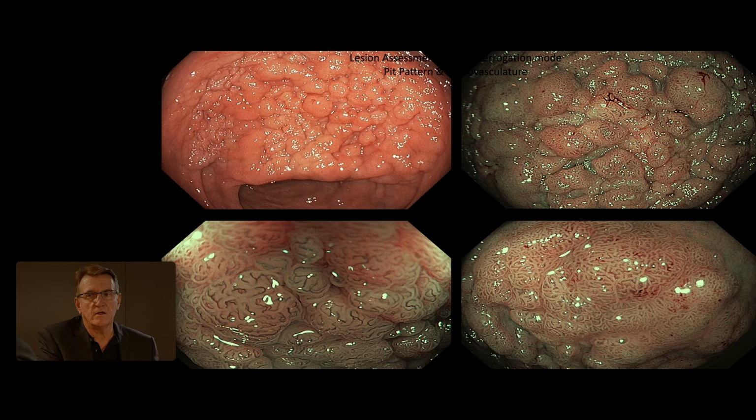So this is a benign lesion. The background of my question, a little bit provocatively, is that I've seen quite a few live demos where somebody said this could be a little bit irregular, with the intention to do ESD. And of course, histology the next day shows a low-grade adenoma. So that's not the challenge. If it's homogeneous in overview and you have some focal views, then you can be not 100%, but very, very sure that this is a benign lesion.